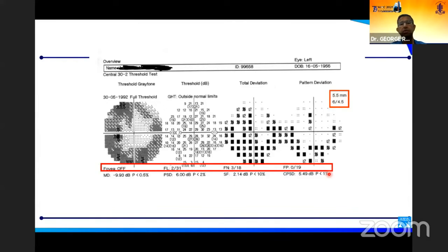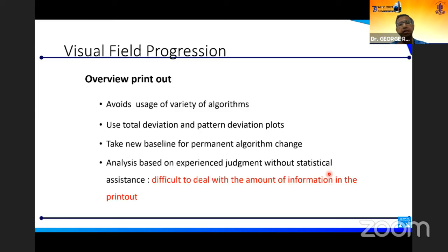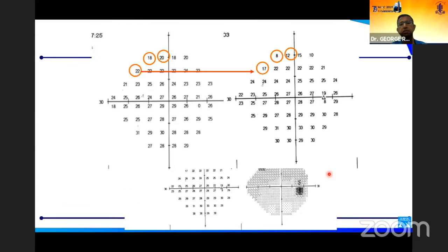So you can look at reliability, the mean deviation, VFI, whatever you want, and compare it further down along with the pattern. But the challenge with this technique is that while it avoids a variety of algorithms, it is difficult for us to deal with the amount of information in the printout. Suppose you start looking at the actual threshold values on the printout. You can see that at these three points, the threshold values are actually reduced.